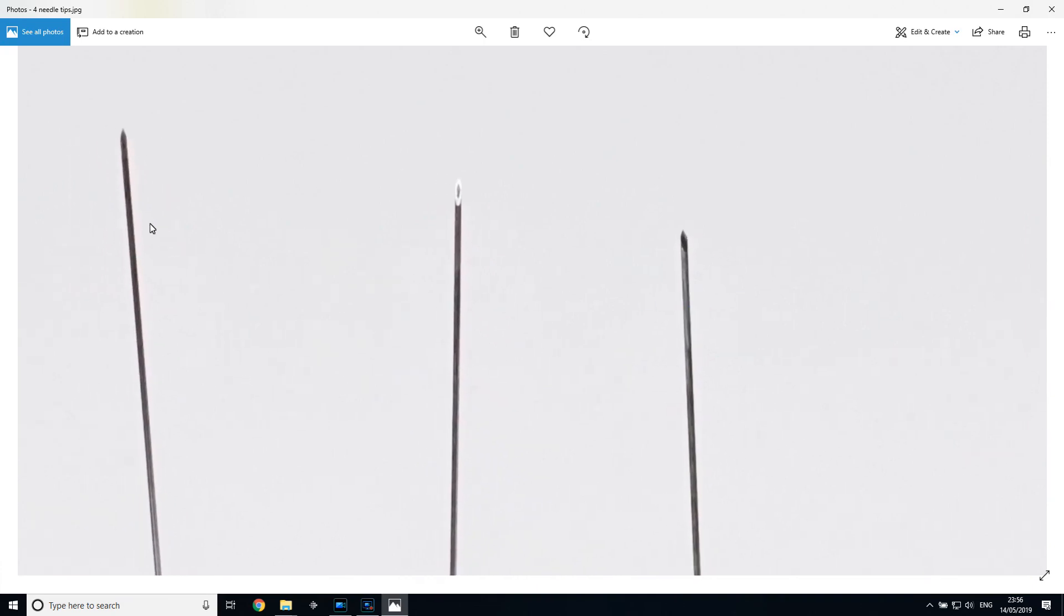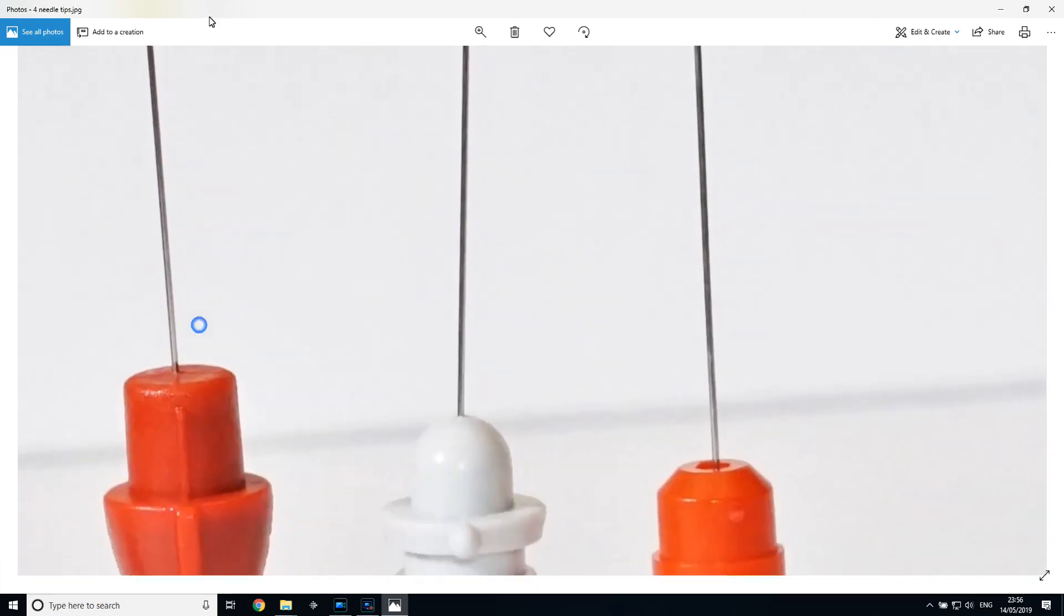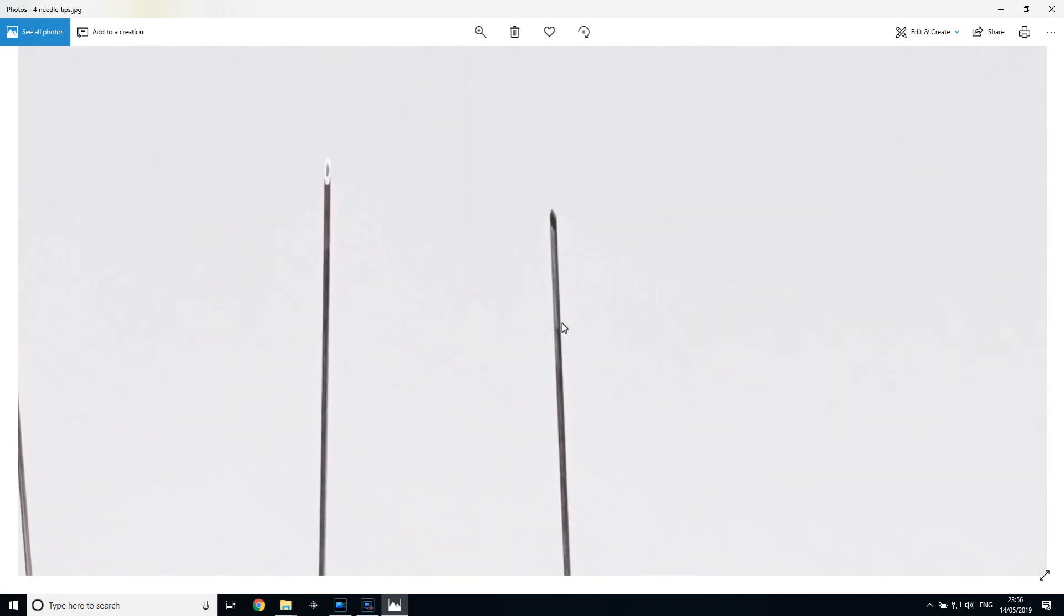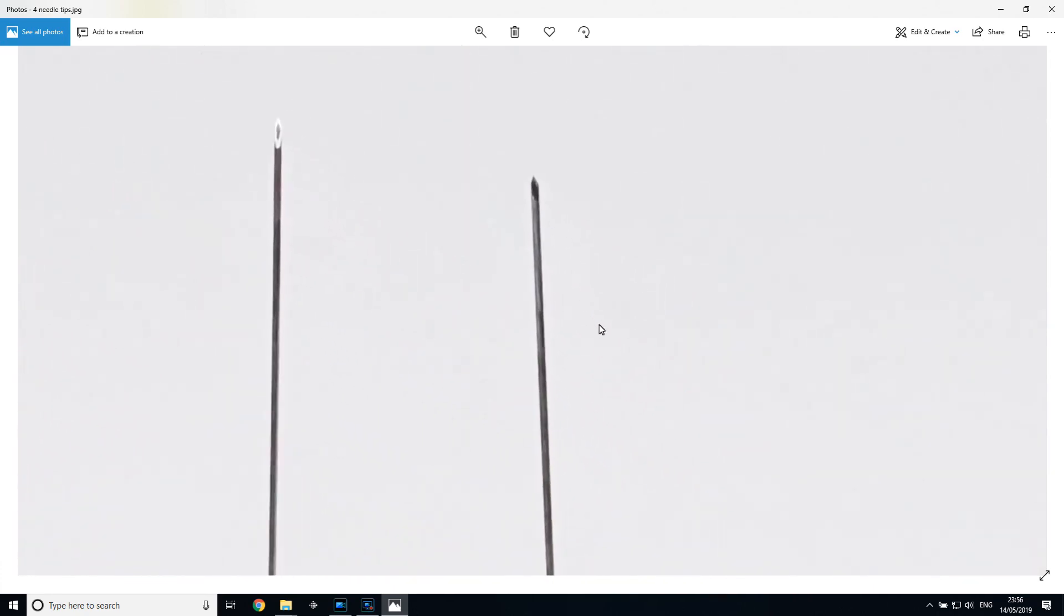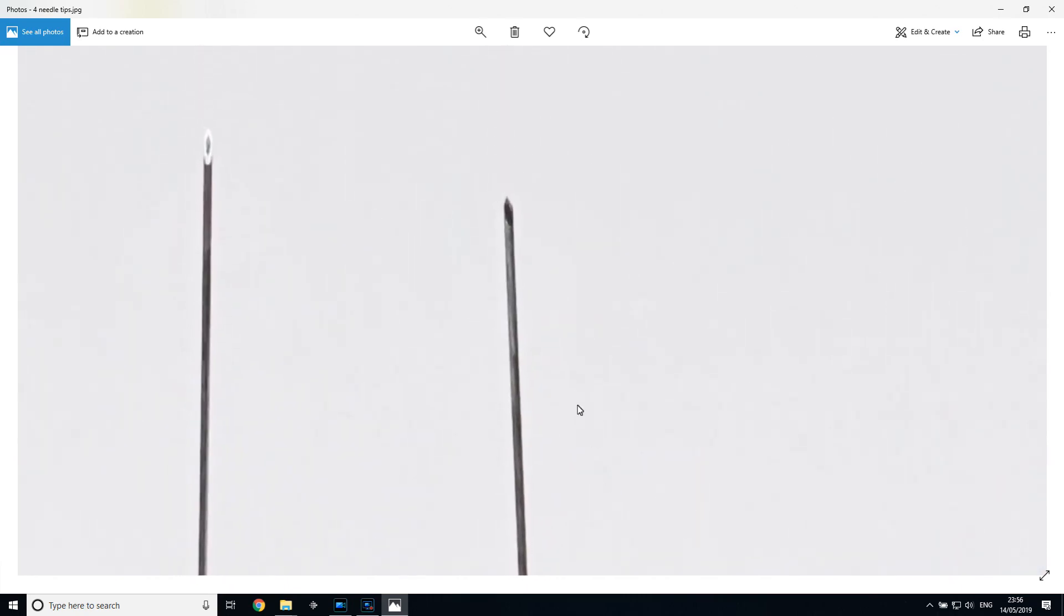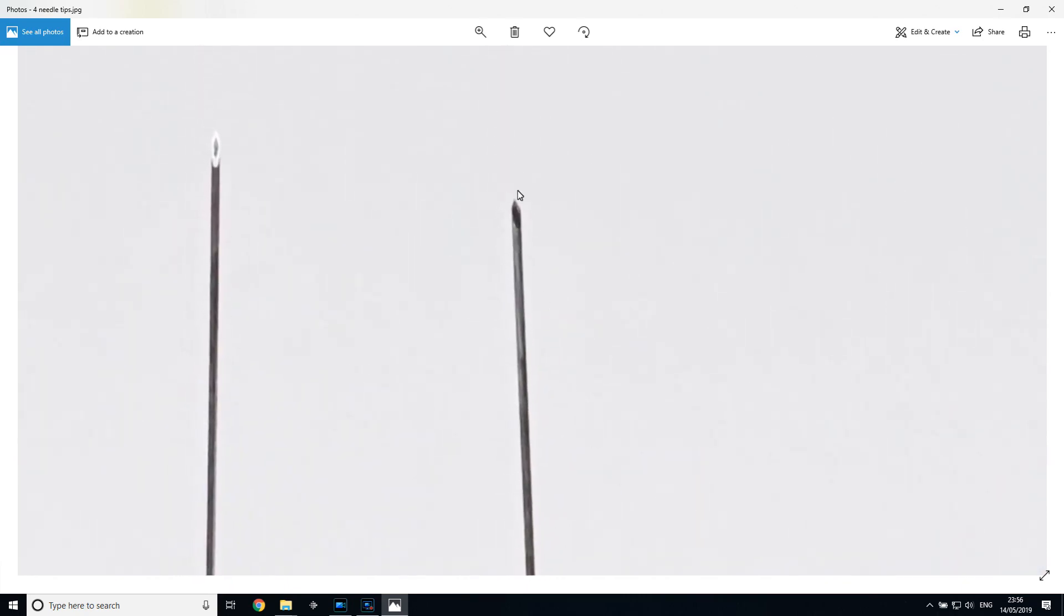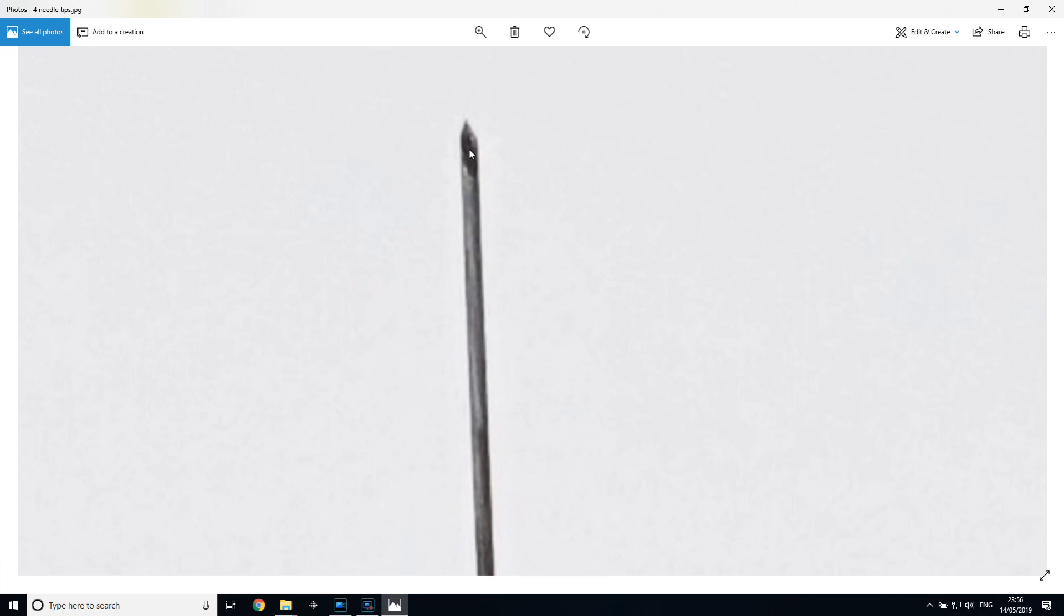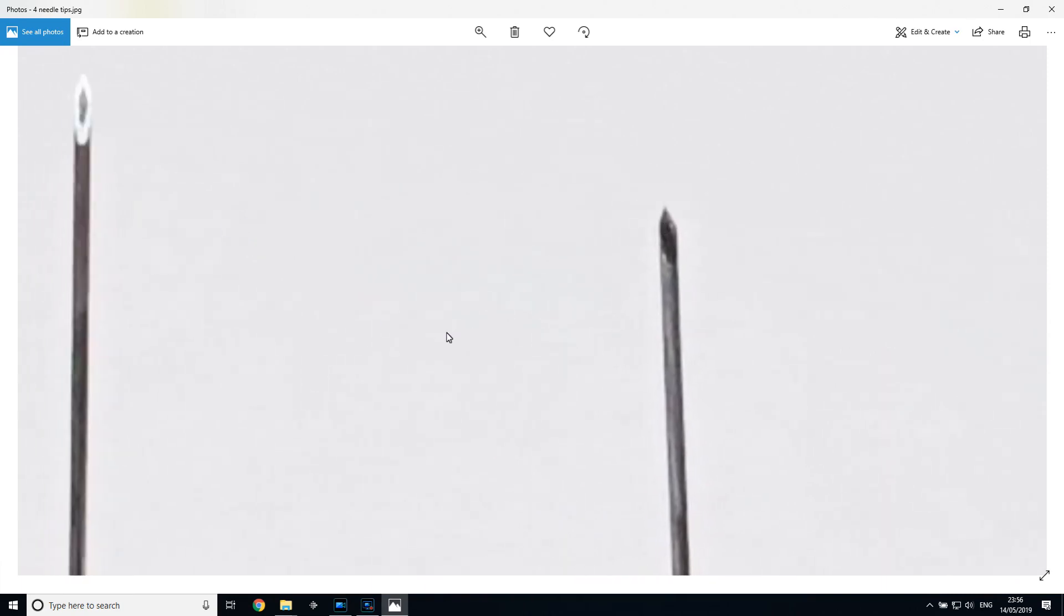And I'm sorry but the Technomed one is just slightly out over there, but we'll have a look at the Tecca one in a bit more detail. That's more within the plane of focus. You can see very clearly over here that its tip is actually different in shape to the Ambu one. So whereas the Ambu one is a bit more teardrop shaped, this has actually got more of a diamond shape at its tip before it becomes more oval.